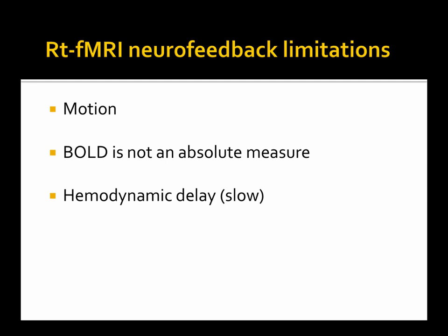So if I'm trying to control my brain to increase a signal, and I don't see that happening, I may change my strategy before the system responds, because it will take at least these 2 seconds. So it's something to be aware of when you give instructions, and that's a very important point in any neurofeedback. What do you tell your subject to do?